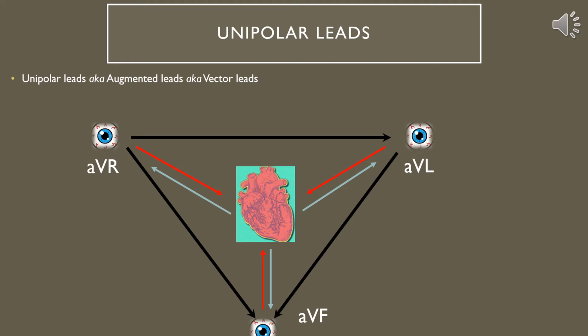And instead of using the negative positive lead measure, they were able to create a grounding lead to the patient's right leg that counters the positive lead on the left leg. So this grounding electrode effectively puts a negative aspect on the physiology of measuring the lead conduction, and that's right in the center of the suprapubic area or chest cavity.